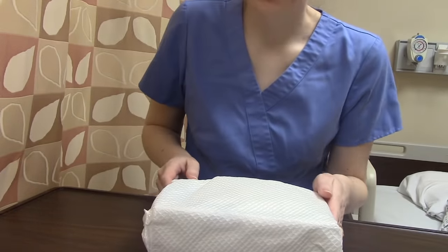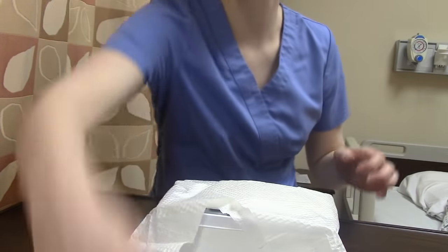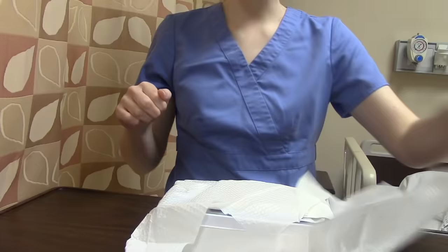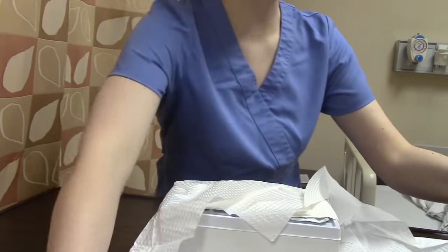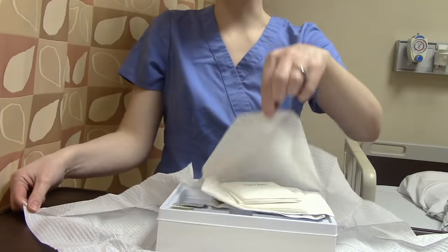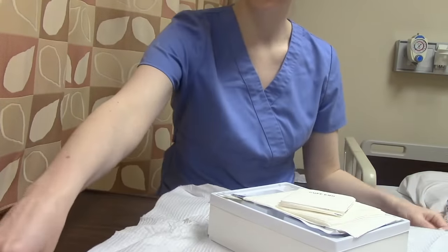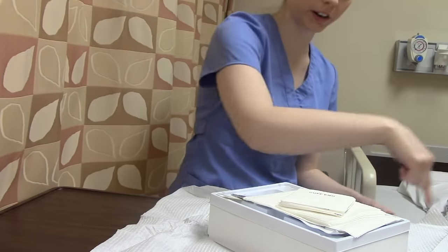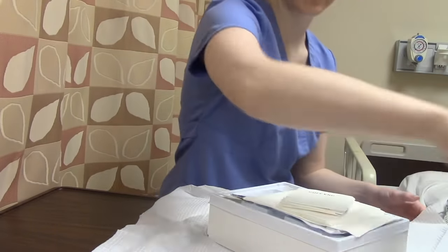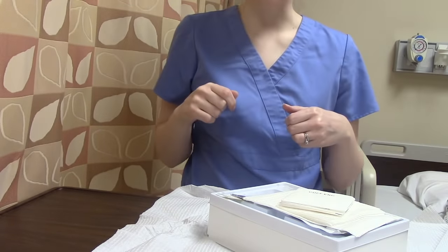When we open a sterile package, we first open away from ourselves, then each side, and then towards ourselves — I always give it a little spin. This one-inch border is considered not sterile. Now we can get our things out.